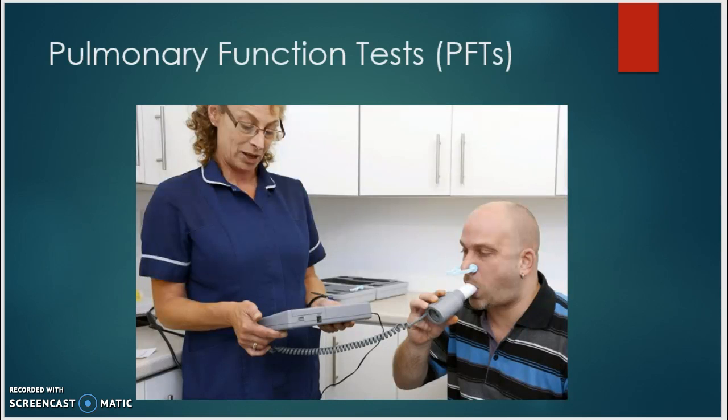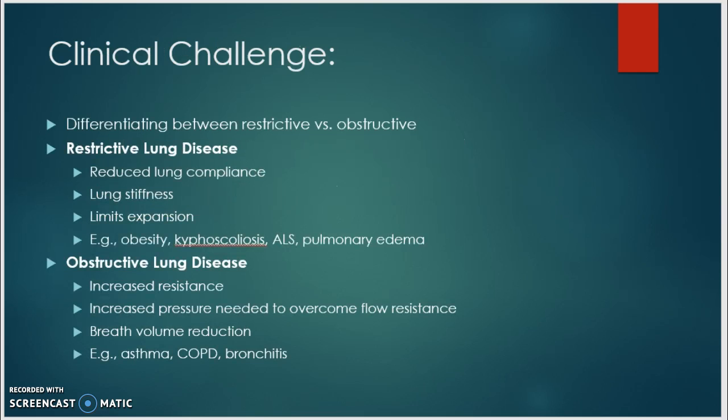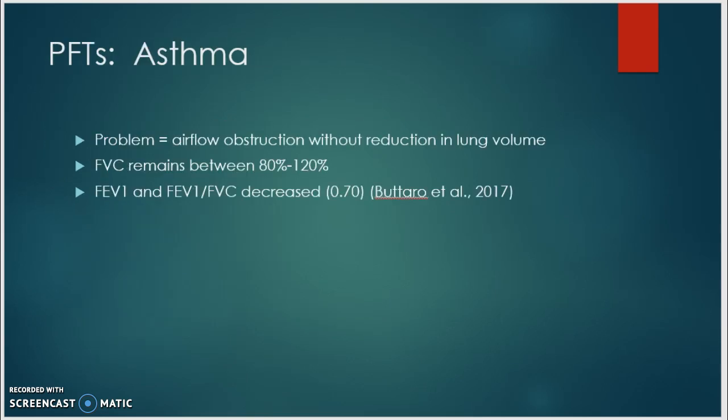In regards to the pulmonary function test, we are almost done. Just bear with me a few more minutes, and we're just going to skip down to the slide that we left off at. We were talking about the different types of lung diseases and what exactly that's going to look like whenever you perform a pulmonary function test.